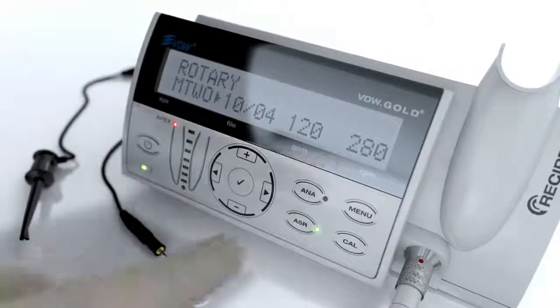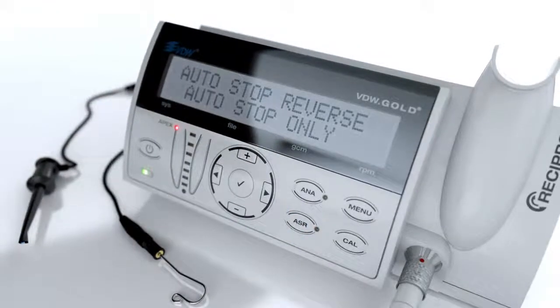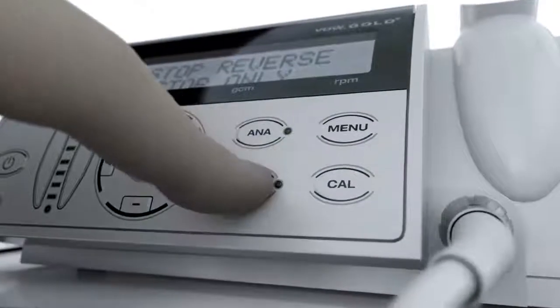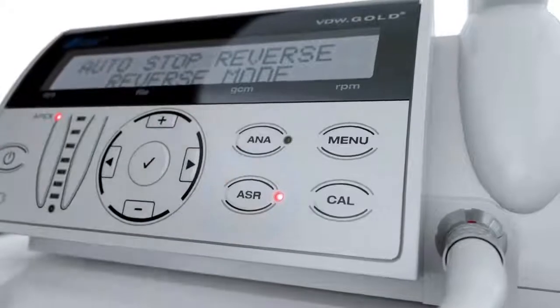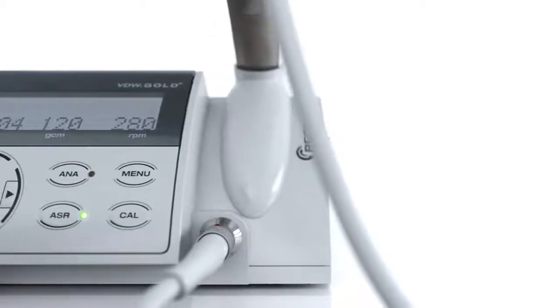When the ASR key is not lit, the motor stops once its torque limit has been reached. However, the motor will not reverse in counterclockwise direction. When the ASR key lights red, the motor will turn in counterclockwise rotation only.